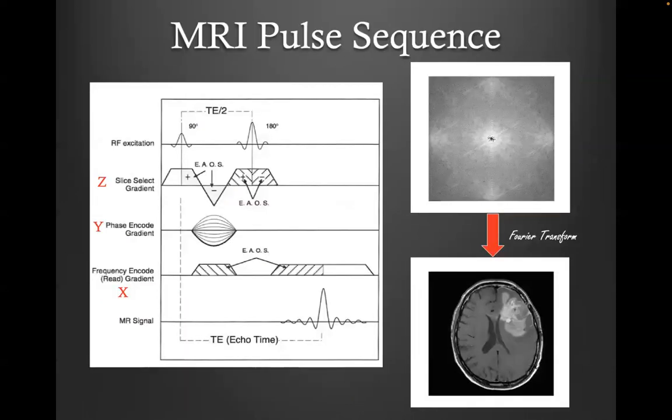And your MRI imaging sequence is a series of events that we plan out. That's what imaging physicists' job is, to program these imaging sequences and all these different events. And they are tightly time controlled so that you can manipulate the frequency and the phase of your protons and give the signal that you want.